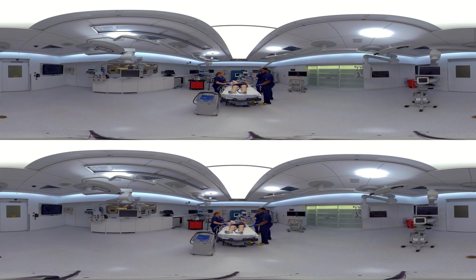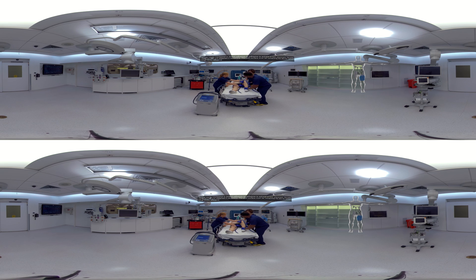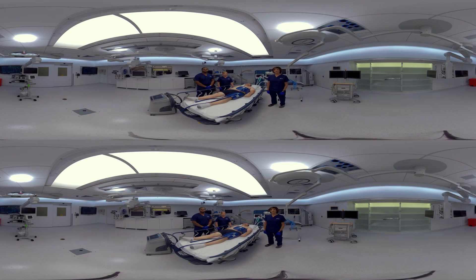Next, we'll do the thigh pad. We can simply lift his leg and place the pad from about the knee to the hip and wrap that wing around the back. The hoses are always going to be anterior to the patient and pointing towards the patient's feet. Now we're going to repeat the procedure on the other side.